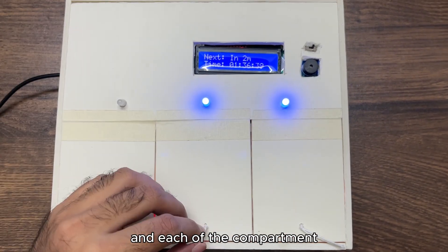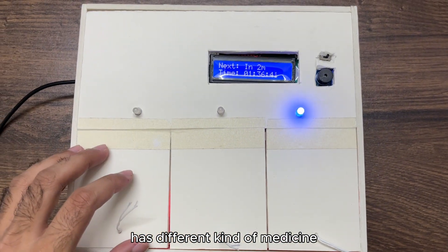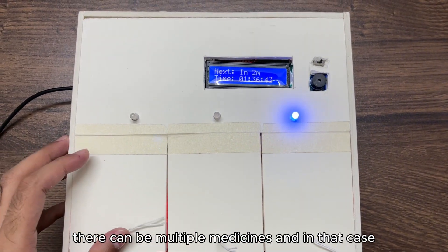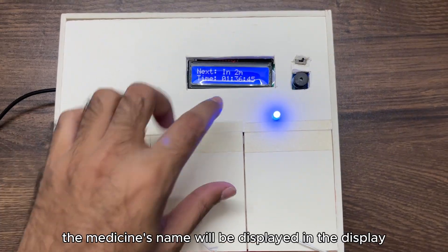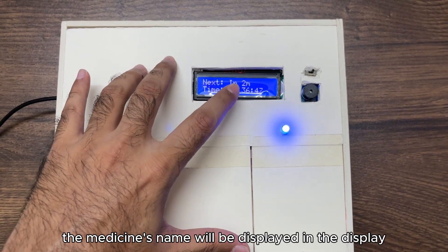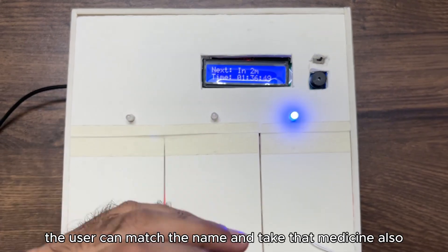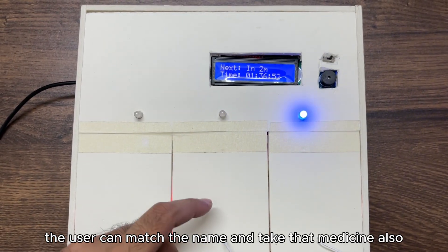There are three compartments and each compartment has different kinds of medicine. There can be multiple medicines, and in that case the medicine's name will be displayed on the display so the user can match the name and take that medicine.